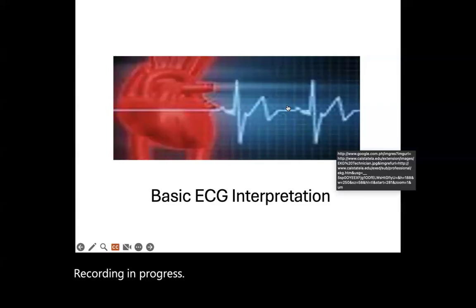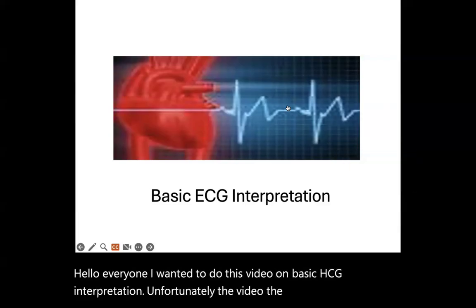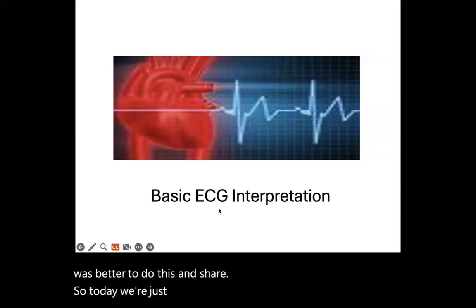Hello everyone. I wanted to do this video on basic ECG interpretation. Unfortunately, the meeting that I did yesterday on the rate, rhythm, axis did not record, so I thought it was better to do this and share. So today we're just going to be talking about basic ECG interpretation.